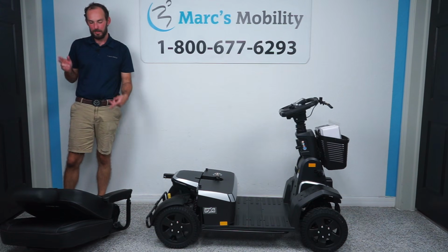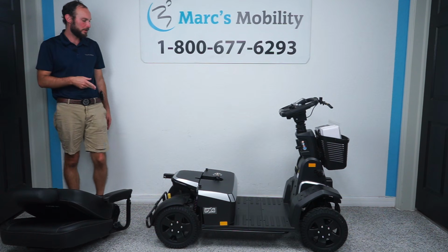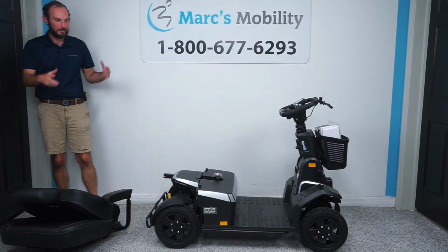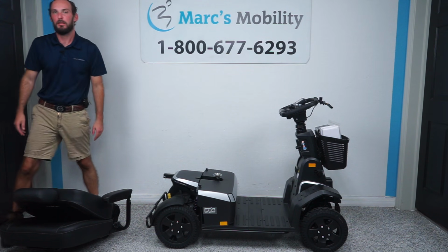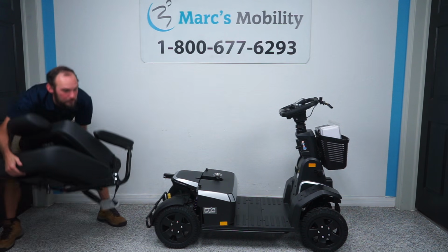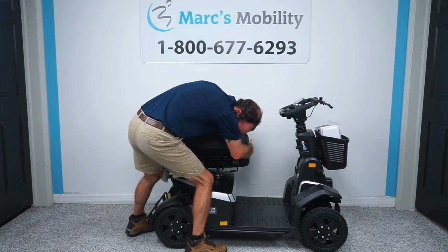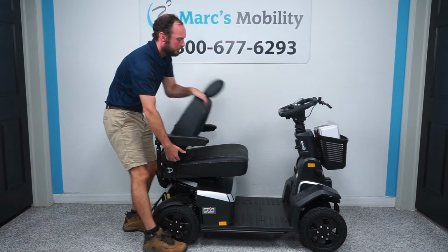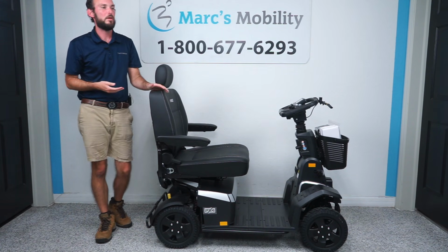Now we're going to put the seat back on. Once again, I strongly recommend a second person for this portion. It's a heavy seat. It's really hard to line up, really hard to see. You kind of have to tilt it towards you. I will show you, but I would just recommend a second person for this. There we go. So that is how you install new batteries into your PX4.